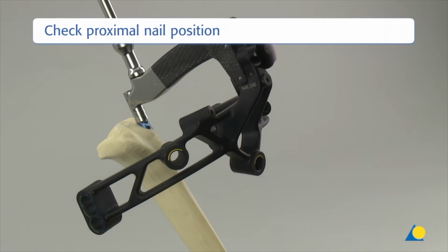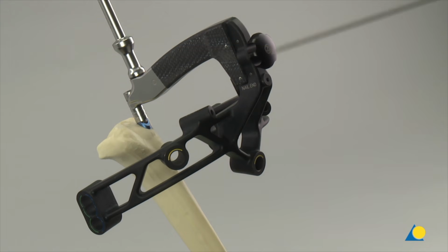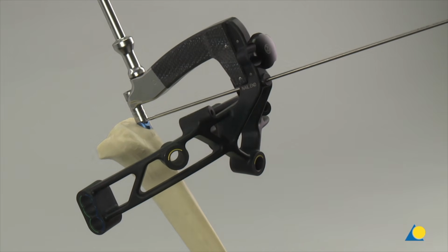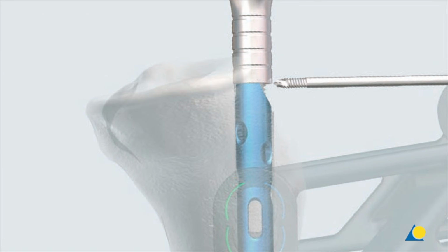To check the proximal nail position, a guide wire 3.2 mm diameter is inserted through the hole in the aiming arm marked nail end down to the bone. The tip of the guide wire indicates the exact proximal position of the nail. The proximal position of the nail is verified under image intensification in the lateral view.